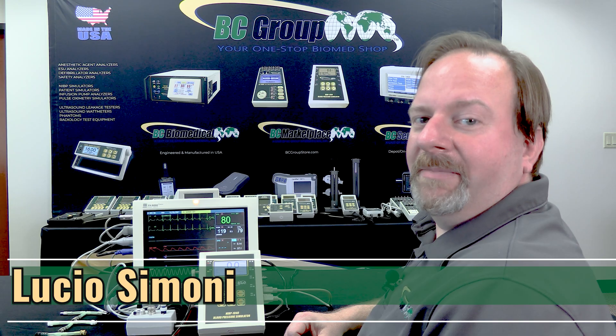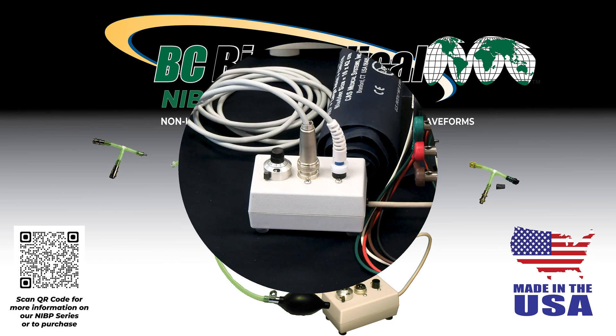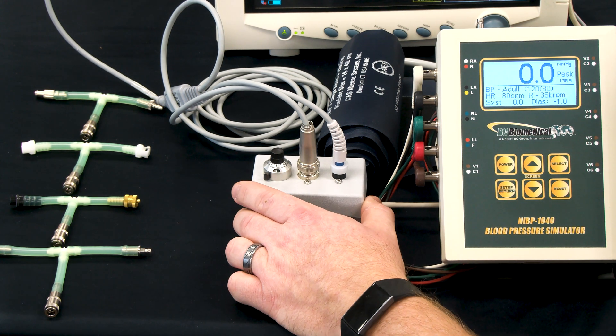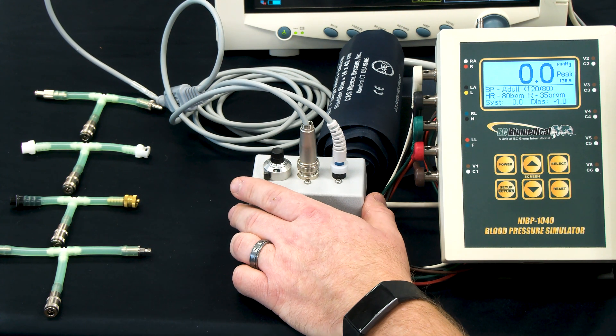My name is Lucio Simone, I'm the Engineering Manager for BC Group, and in this series of videos we'll be demonstrating NIBP simulation using the NABP 1040. For the NIBP 1040 kit, you'll receive the NIBP simulator plus the cardiac output module MCO 2100 and the four adapters for the blood pressure cups.